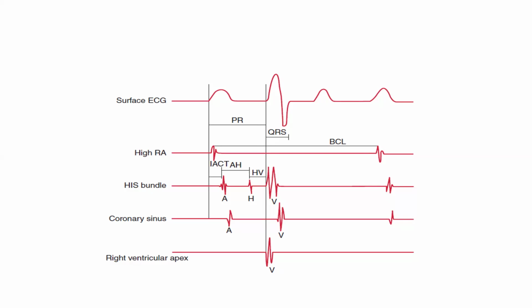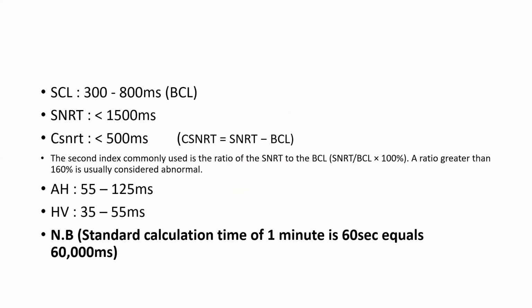All right. So we already understand our basic cycle length. With basic cycle length, you are trying to determine the heart rate, just the same way we talk about the PP interval, to get the heart rate or SA nodal rate. Now, we all know that cycle length varies, right? So it's always good we correct for cycle length. One important aspect is that we use cycle length to determine SA nodal function.